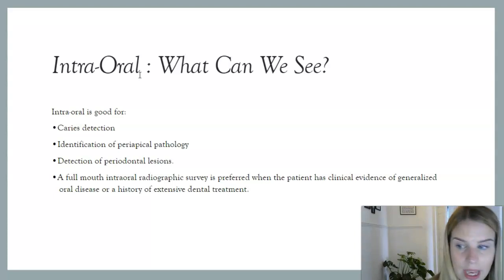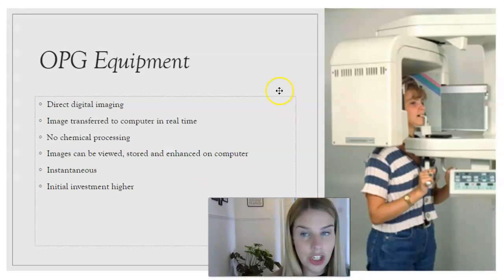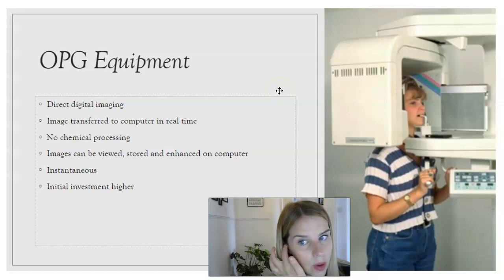Intraoral imaging is really helpful. So when we're talking about an OPG, this is the equipment that we're talking about.